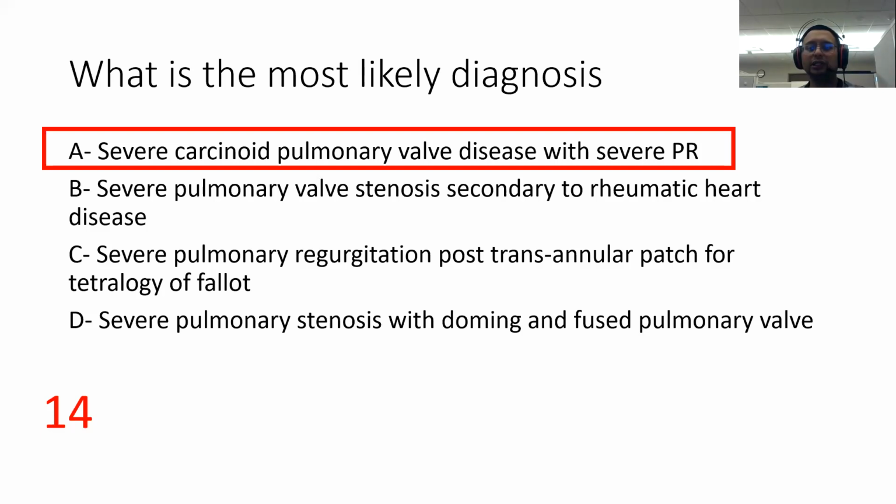Okay. The hormone is what causes changes in this leaflet. So this leaflet tip is not that the carcinoid mass itself is going into the leaflet. No. It is the changes of the leaflet secondary to this hormone. So the changes will be restricted and retracted. So you see the valve is like half open like that.